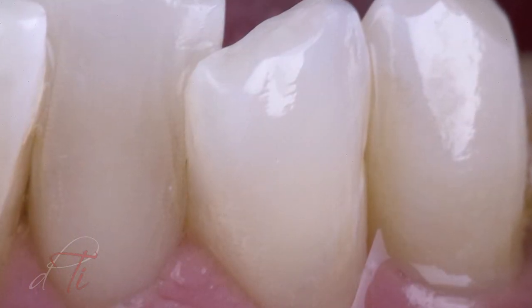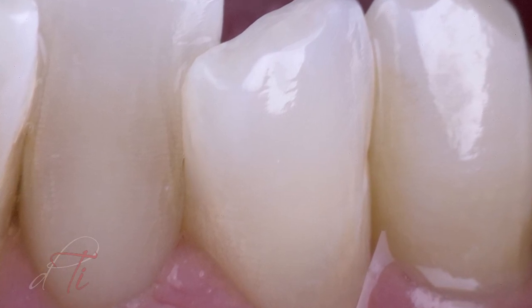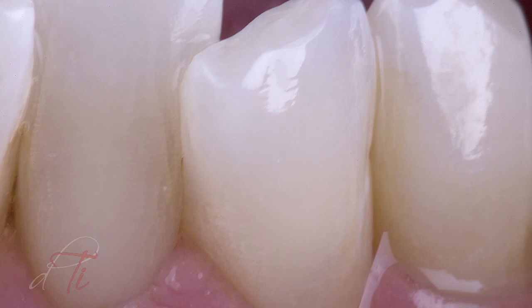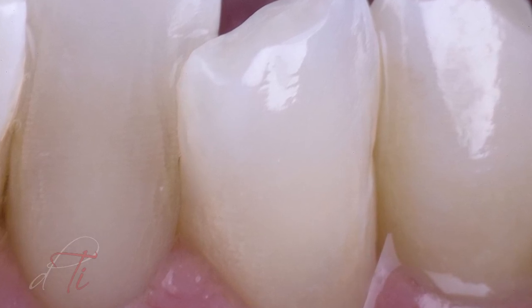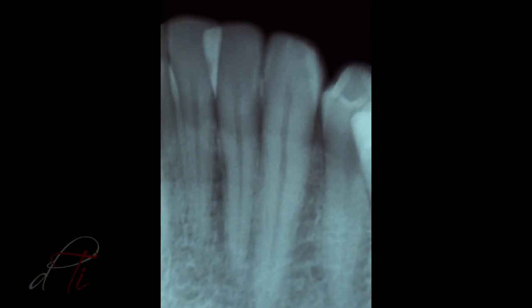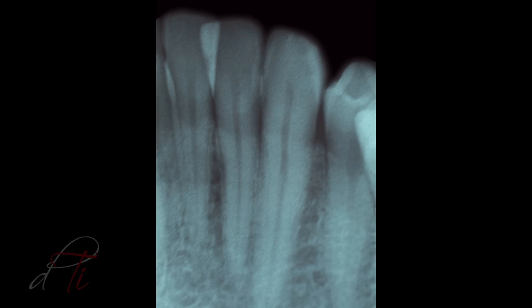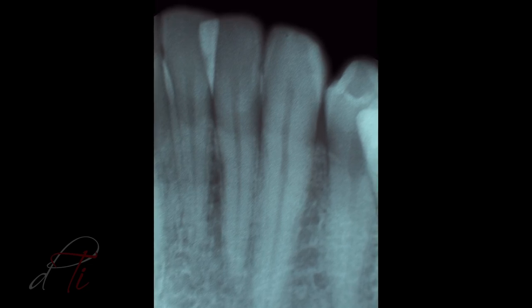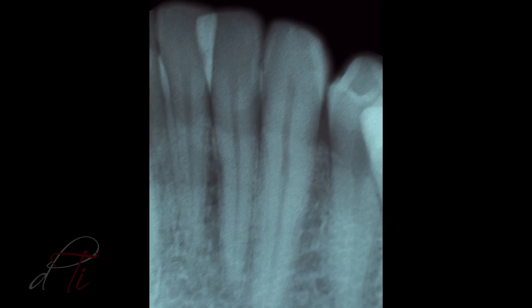The following restorative procedure demonstrates the optimal aesthetic results that can be achieved in the interproximal zone through proper adhesive protocol and a simplified application of flowable composite resin. Also notice the radiopacity of Genial Universal Flow is similar to enamel, which makes it easy to evaluate the interface and to identify recurrent caries.